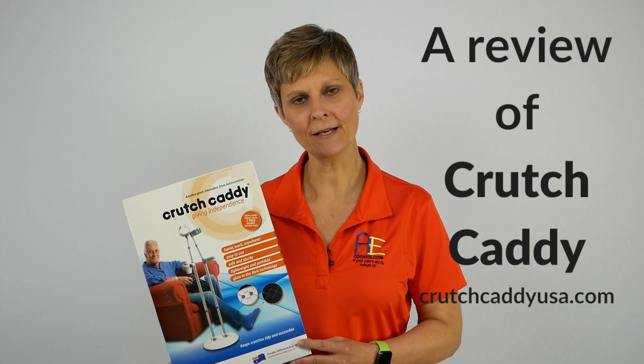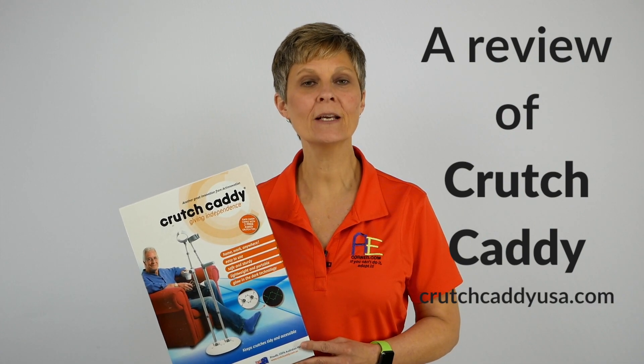Cindy here, physical therapist with Adaptive Equipment Corner. Today we're going to take a look at a product called the Crutch Caddy. It was sent to us by a company in Australia.